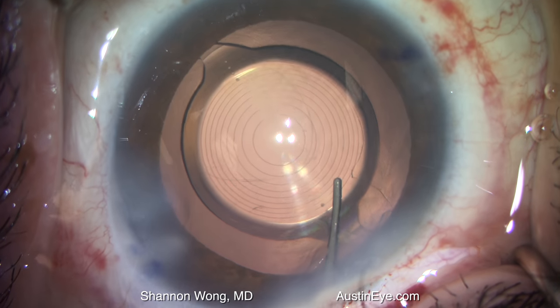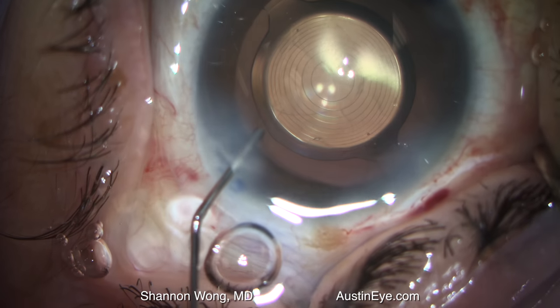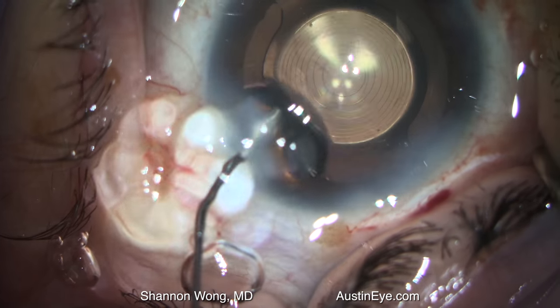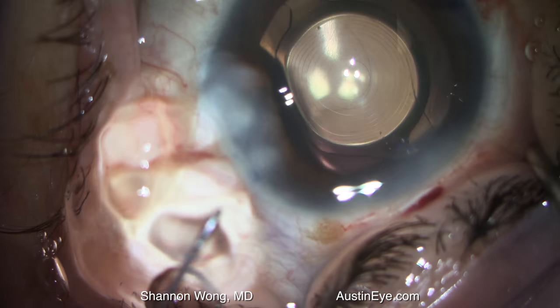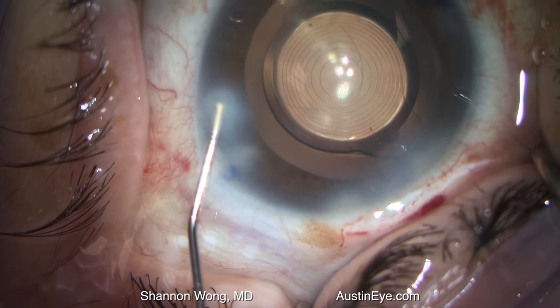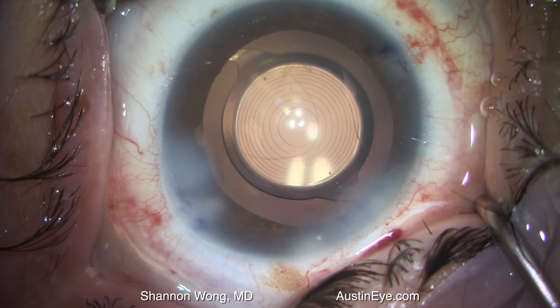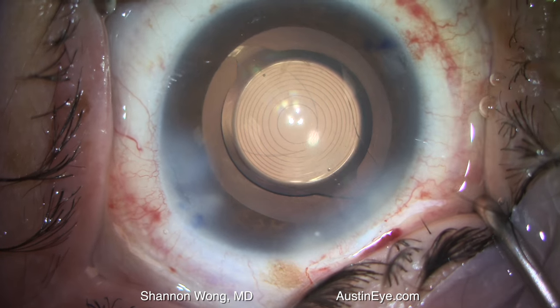To remove the viscoelastic, we used balanced salt solution to irrigate the Healon GV out. I elected not to use a vitrector or an irrigation and aspiration instrument, feeling that would possibly move the lens out of position. The case concluded with a perfectly aligned implant.